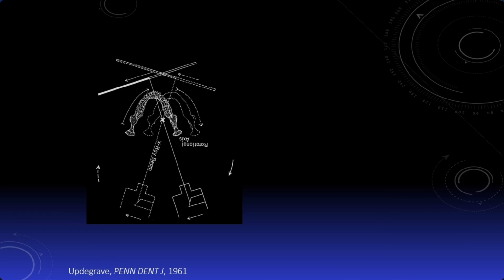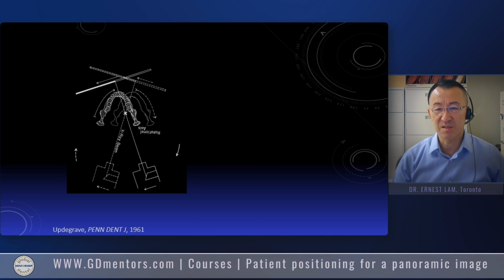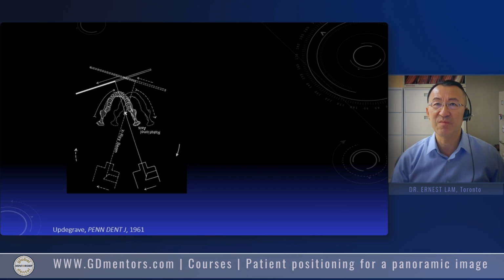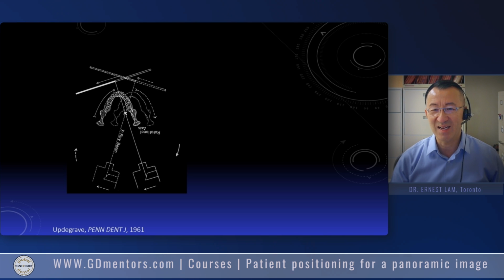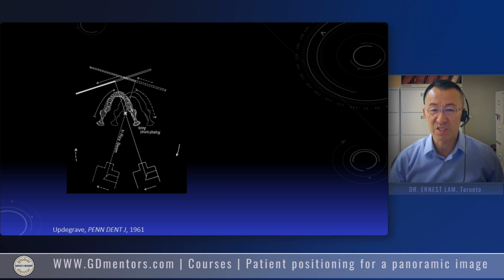Older X-ray systems that incorporated this concept utilized a series of pivot points that were located lingual to the tooth arch and the mandible. And the very first systems actually did this quite mechanically in the sense that half the image was created, and then the entire system came to a stop.